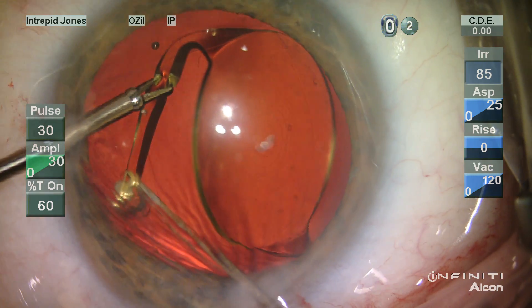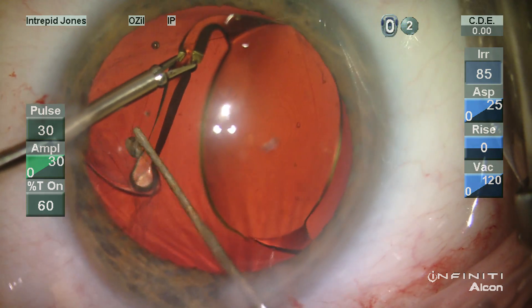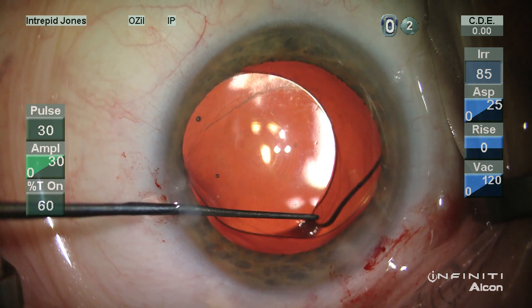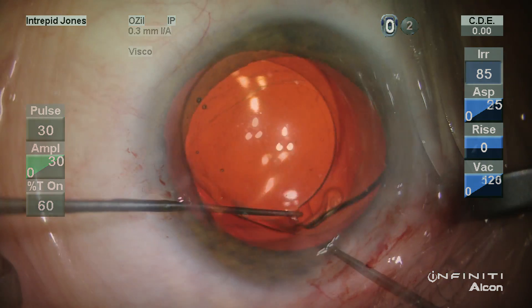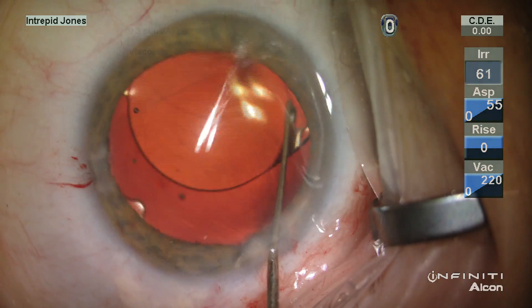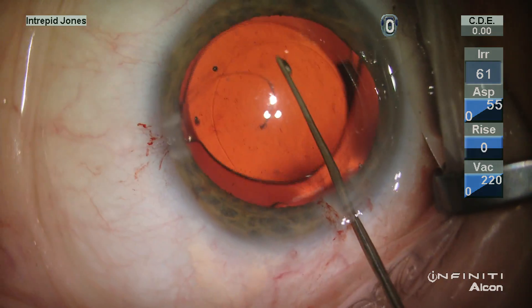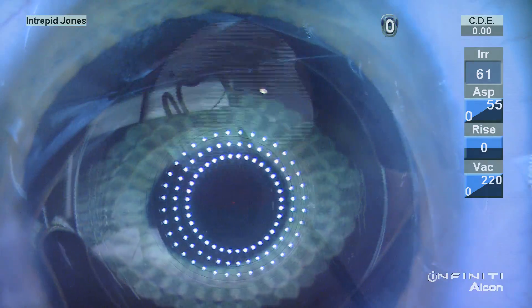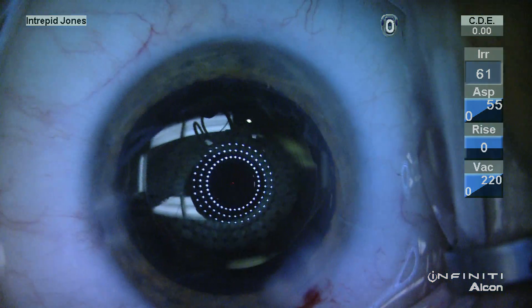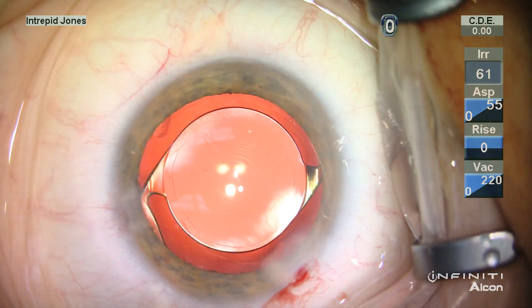During viscodissection, it was apparent that this lens haptic had become stuck to the end of the islet of the capsular tension ring which had been placed in this mildly myopic patient. With careful viscodissection and blunt dissection with traction, the lens was freed, then rotated 360 degrees with its final position confirmed using the fixation light and concentric alignment of the keratoscopic view. This patient had an excellent outcome and stable recovery.